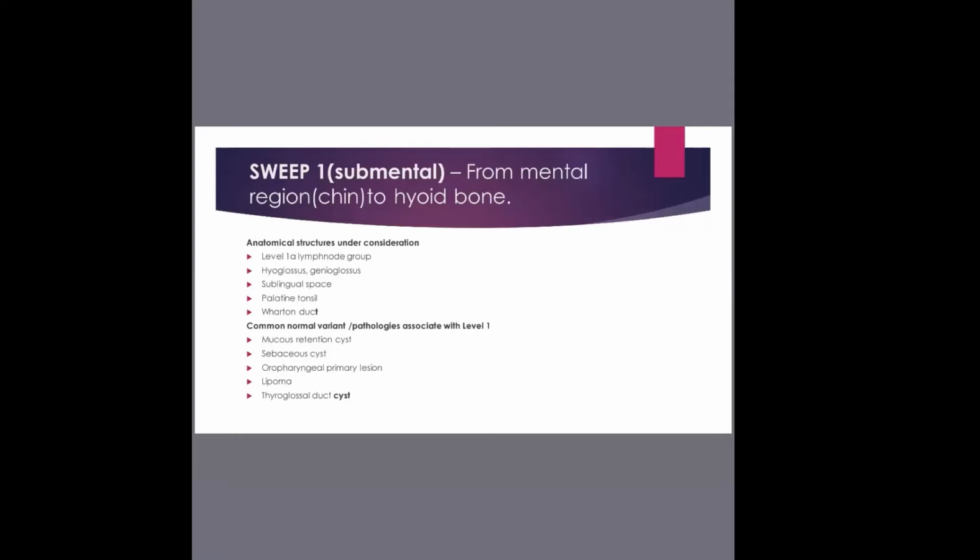But you've given them all they want to know: is it enlarged or not, and did you see what's causing the enlargement? If you don't see anything causing it sonographically, then that's when they go for biochemistry. So your focus should be more on the appearance, the echo texture, because it is the echo texture that tells a lot about what's happening to the thyroid gland.